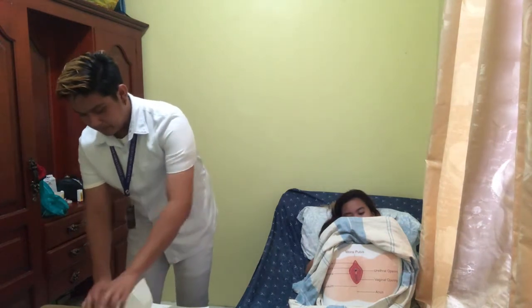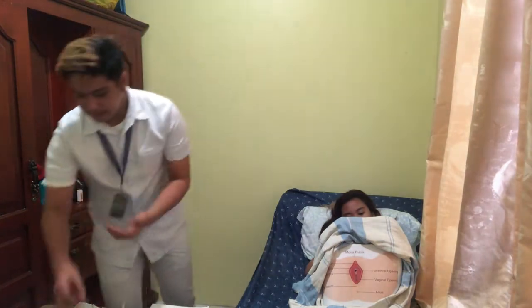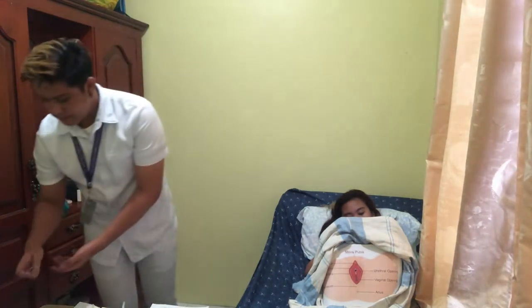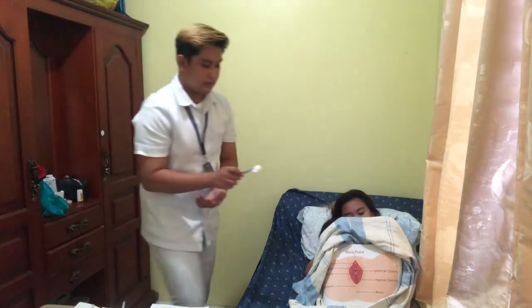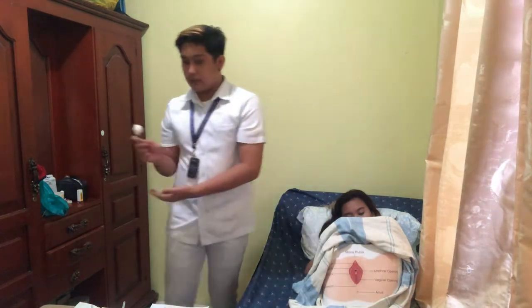So now we'll start the catheter process by opening the tray and arranging the equipment for convenience and accordingly, and also making sure to avoid contamination of the sterile items. Okay, so then using the sterile forceps, cleanse the area using the cotton ball with betadine. Cleansing the meatus and the surrounding area will reduce the spread of unwanted microorganisms to the patient's bladder. Okay, so discard the used cotton ball.